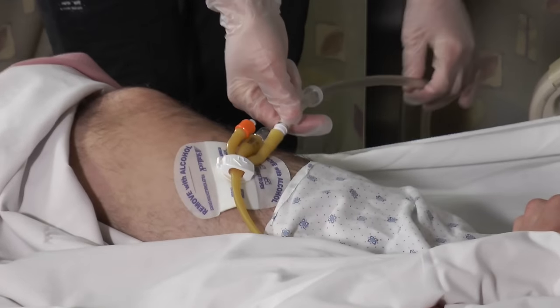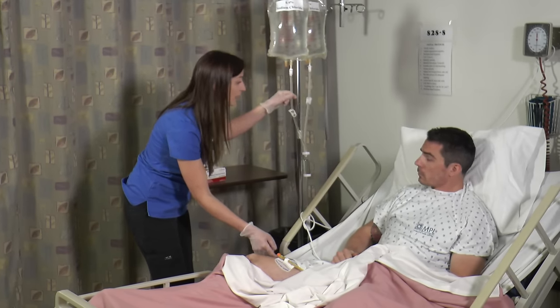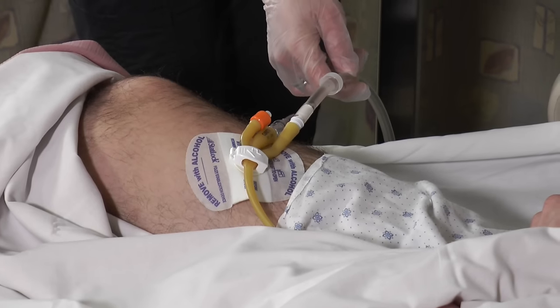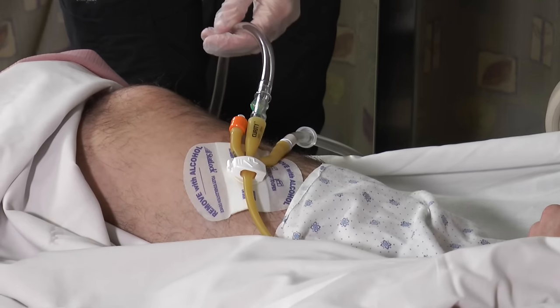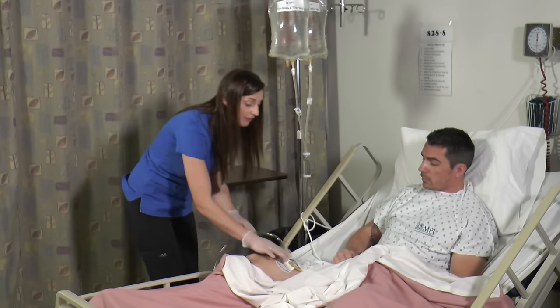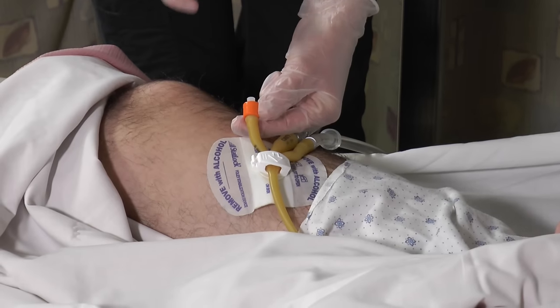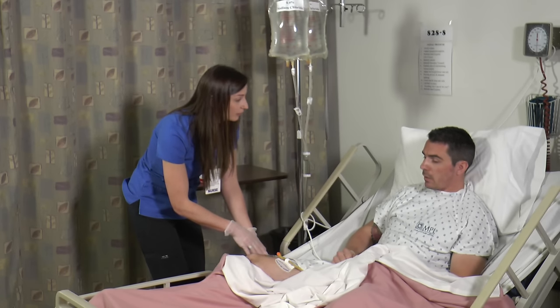So this first channel is for the infusion of the sterile solution that the physician has ordered. And this continuously irrigates the bladder. The reason we have this is to prevent the formation of a clot after the surgery. The second channel is for the drainage of the solution that goes in and irrigates the bladder and then comes out into the gravity bag. And this third channel is for the inflation of the balloon that we inflate in order to hold the catheter in place in your bladder. Okay, so do you have any questions about this catheter itself? No, that all makes a lot of sense.